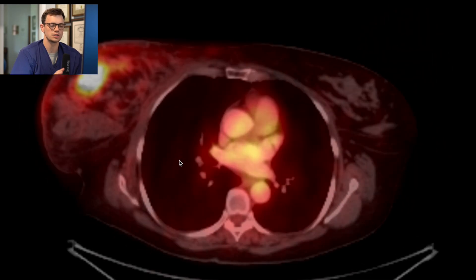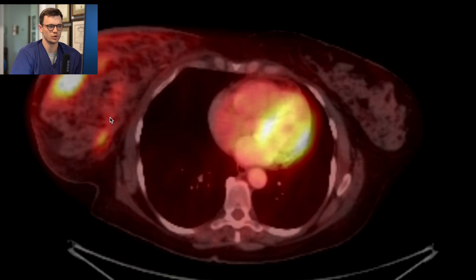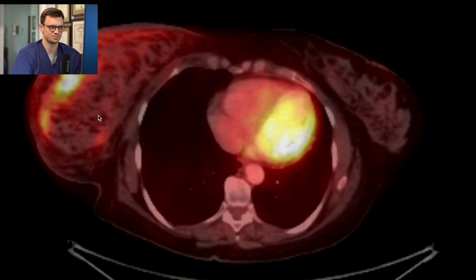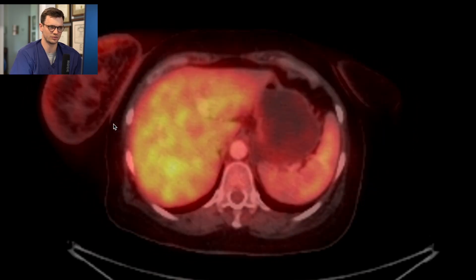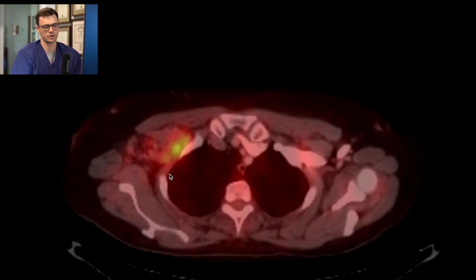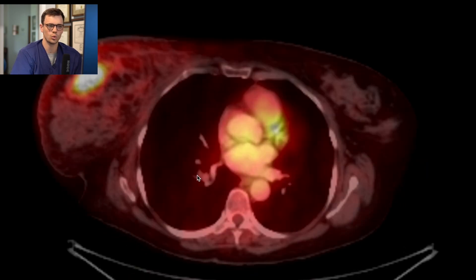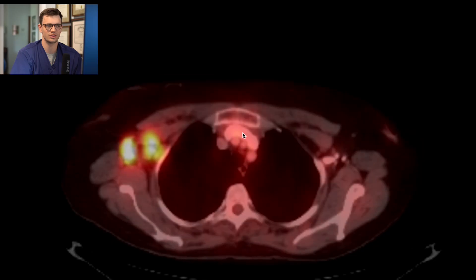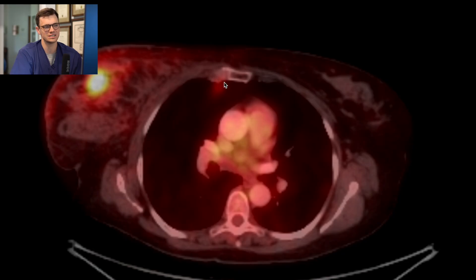Now we're at the spot where there's actually pathology. Let's look at the right breast — it's not subtle; it's very, very hot in the right breast. It's actually multiple spots — this is a multi-centric tumor. There's a lot of increased activity in the right breast. Clearly this is our primary tumor; this is known breast cancer. Breast cancer loves to go to axillary lymph nodes — those are the nodes that drain the breast. These are all hot axillary lymph nodes that are metastatic. Looking at the other side and other lymph nodes, remember those internal mammary lymph nodes can show up hot in breast cancer. There's increased activity there on the side of the cancer — that's probably an early internal mammary nodal metastasis.